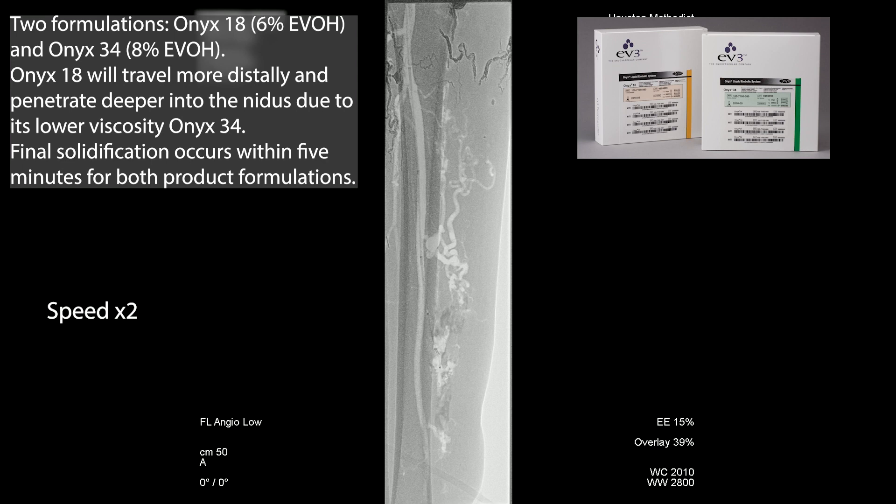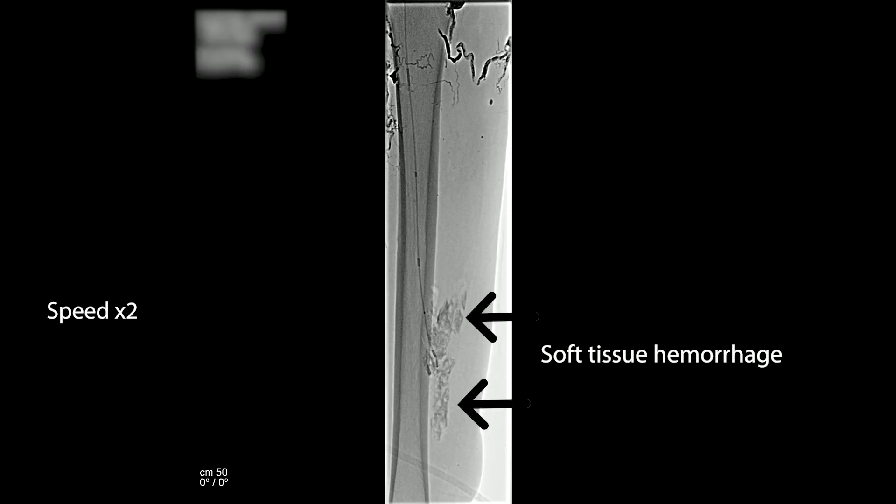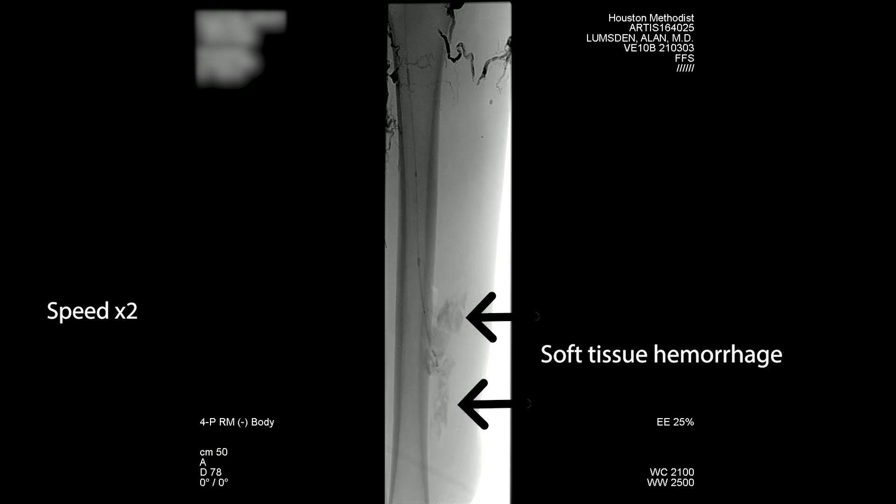Once you get dye in the soft tissue, it makes it a little more difficult to see where the onyx is going. The keys to this are: make sure the catheter is adequately stable. Ideally you want the diagnostic catheter right in one of those trunks coming off the posterior tibial, and then go very selective with the microcatheter. Best to avoid having dye in the background as it makes it more challenging to see what is actually going on with the onyx.